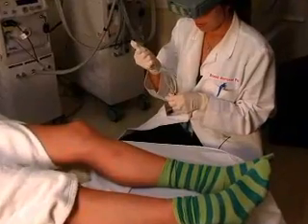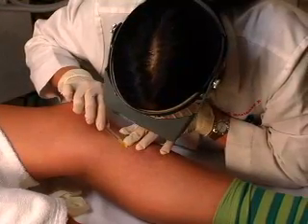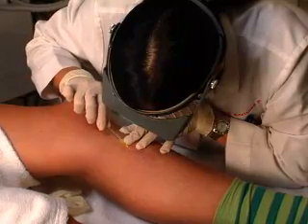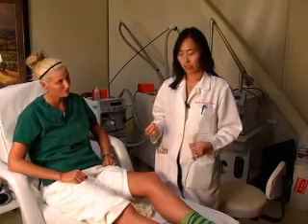Hi, my name is Brandi Moreno. I am a physician assistant and today I'm going to be doing an injection on a leg vein. We're going to be using sodium tetradecyl or sotradecal to inject inside the larger green veins which are feeding into the red veins. We're going to collapse the large vessels and then after that we'll collapse the small vessels.